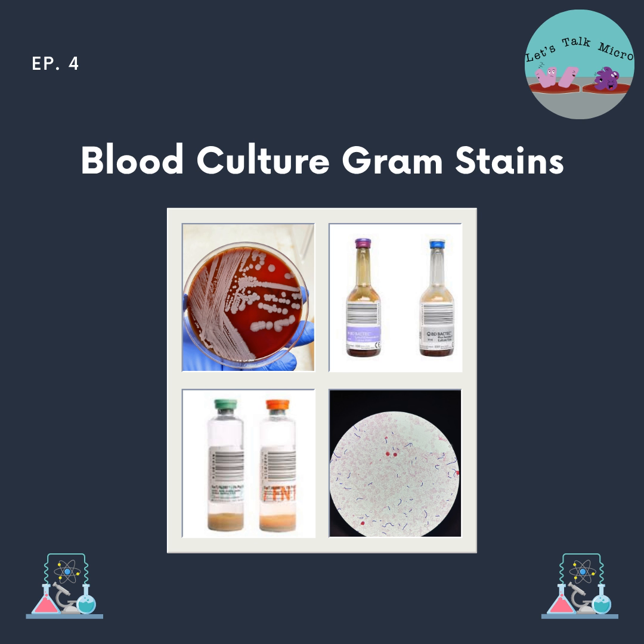So that's how a blood culture works. CO2 is produced, the pH is lowered, and then this is detected by either a colorimetric or a fluorescent reaction. Very simple. And then now that we know how that works, we have our bottle, it is flagged as positive by the instrument, or, let me touch on this real quick, there's a color change at the bottom of the bottle. I didn't mention this. It changes from green to yellow. That's also an indicator that it's positive.